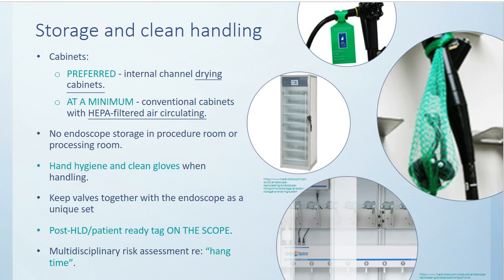We also want those gloved hands coming into the room, taking out of the storage cabinet, and then putting that in a container to go back to the procedure room. So we do want that containerized there unless it's in a controlled connected corridor, is what the standard says. Then you do have a little more leeway of not containerizing that to make sure that it's protected physically from damage in the environment. But we do, in most circumstances, want that containerized.